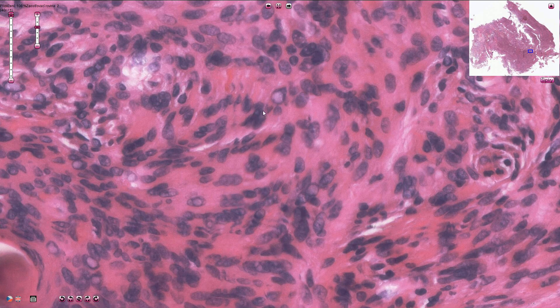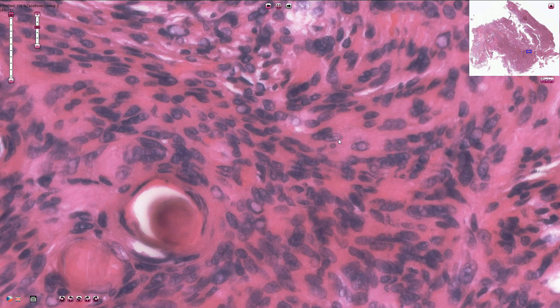In some of these nuclei we can see pseudo-inclusions, which are these bubble-like structures. Sometimes we can also see longitudinal nuclear grooves. Mitotic activity is typically very low, and this is the typical histological appearance of the meningothelial subtype of meningioma.